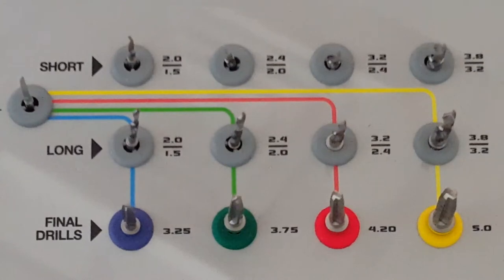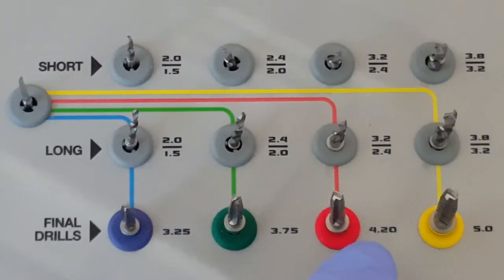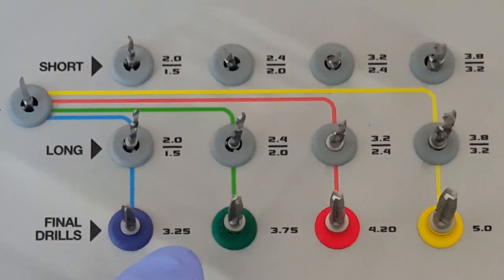The kit is designed for the placement of implants 3.25 millimeters in diameter, 3.75 millimeters in diameter, 4.2 millimeters in diameter, and 5 millimeters in diameter. You will note and see that each one of the implant diameters corresponds to a different color.